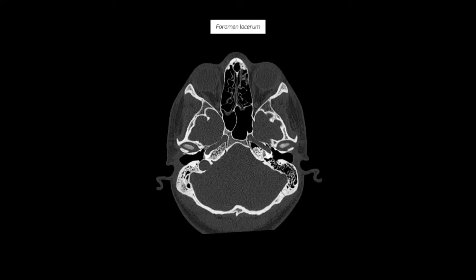If we go up one slice, you'll see that the right carotid canal takes the turn anteromedially and extends up adjacent to the sphenoid sinus shown here. This segment of the carotid artery as it runs along this horizontal foramen is called the lacerum segment, and that's because this area is called the foramen lacerum. Here's the right foramen lacerum and here's the left.